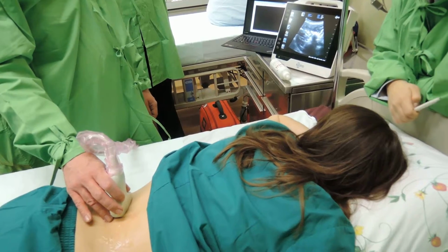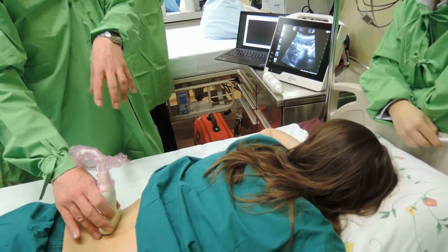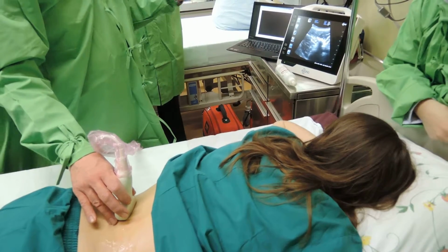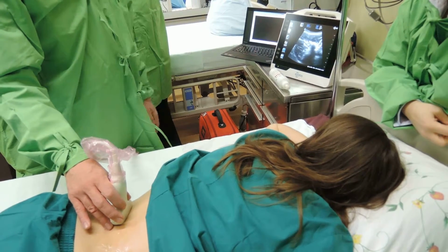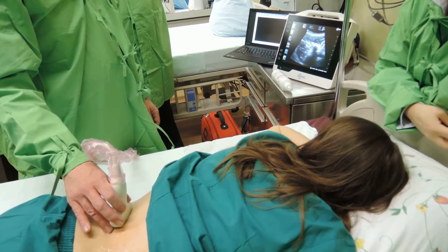You don't need a nerve stimulator in a patient such as her, since you see everything. But in a patient where these structures are 10 or 15 centimeters deep, a nerve stimulator is helpful.